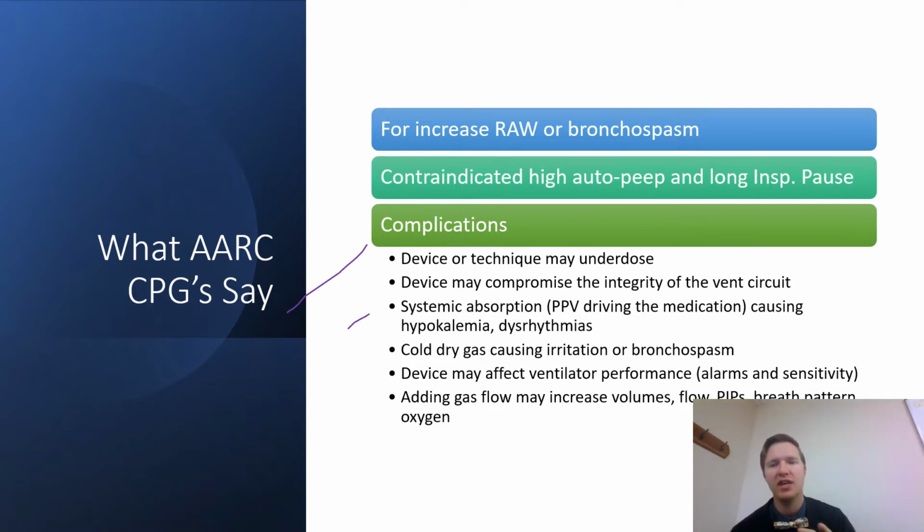We might have better systemic absorption, which is not always best because this medication is designed to be topical. Whenever we nebulize, we're looking at topical absorption traditionally, and this one could have more side effects because we have more driving inertial impaction that could send that medication better into the capillary network and cause more side effects, right? So that's something else to look at.